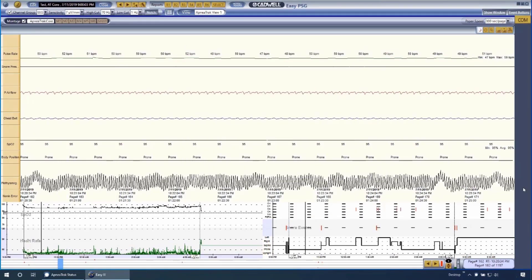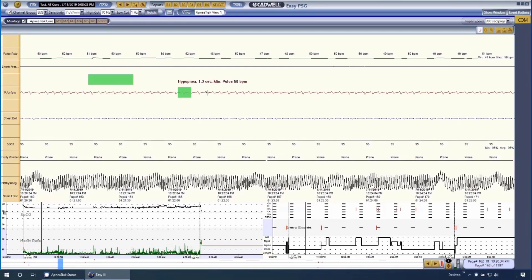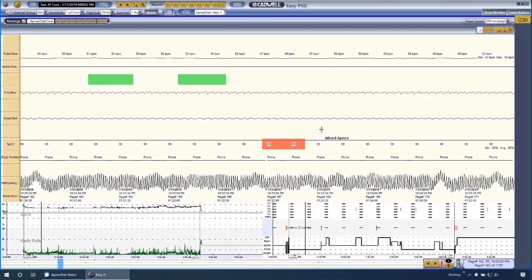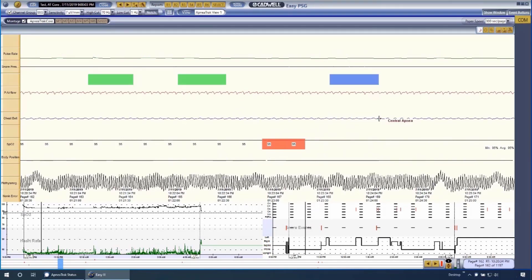Scoring your ApneaTrak study is just like scoring any other EZ3 PSG studies. Respiratory channels can be configured for any respiratory type event and can be marked by dragging and dropping.